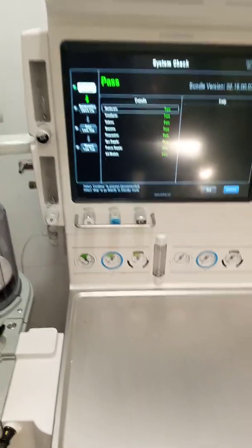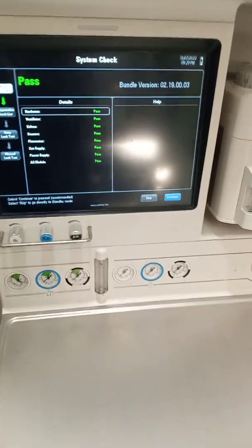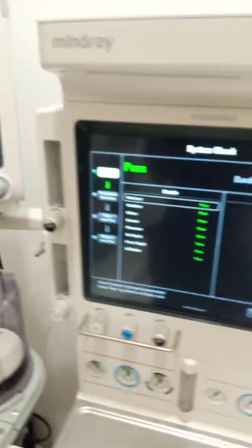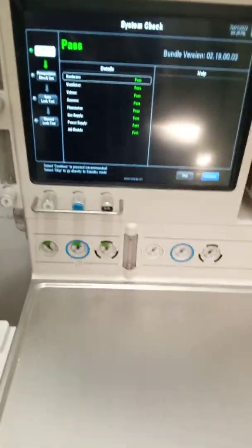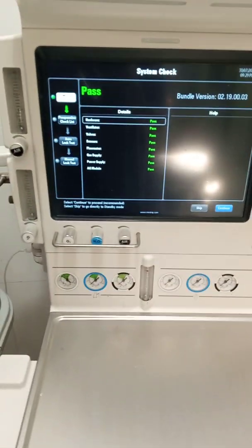This is an interesting feature of the anesthesia machine — it is called a sample line. As you can see, it is connected to the machine here. What it mainly does is it helps record the amount of carbon dioxide that is being exhaled by the patient. This helps us to know whether the patient is ventilating well or not, and it gives us a clue of the patient's end-tidal carbon dioxide.